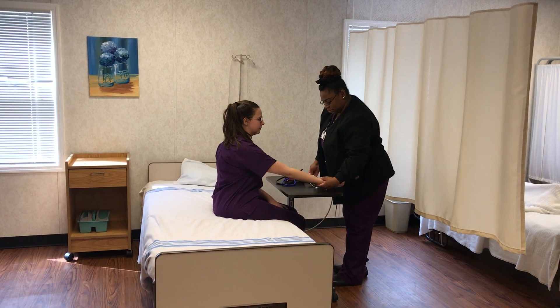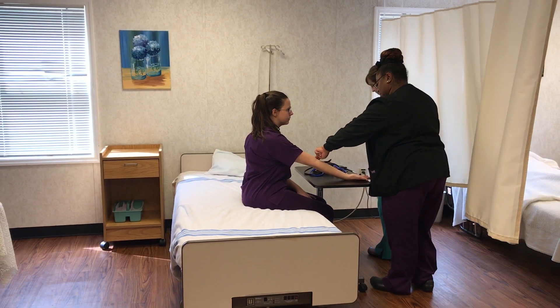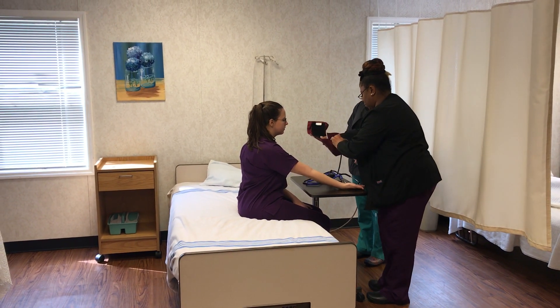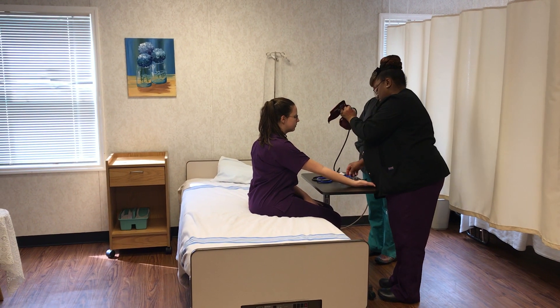You'll check the brachial pulse first. Once you've located it, you'll put the blood pressure cuff on, making sure that you align the artery mark with where you felt the brachial pulse.